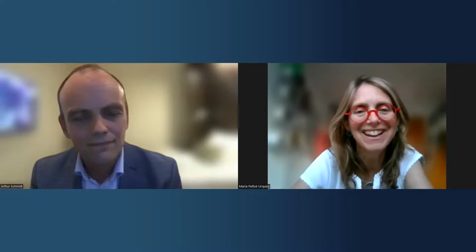So thank you very much, Arthur, for this forefront presentation with these wonderful videos. I think we still have a few minutes for discussing. First of all, I wanted to ask you, because I have seen very technical things, I have seen that you were using the anchoring system for the upper GI. Do you also use it now for the lower GI, or is it something that you specifically prefer in the upper GI?